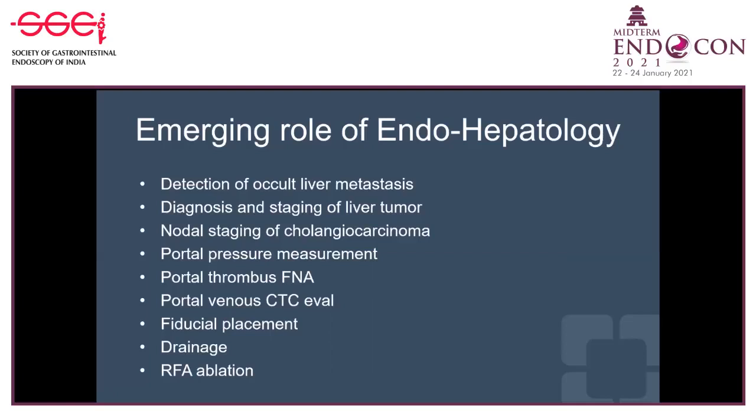We use fiducial placement in the liver for adequate treatment of the liver tumors. And of course, as everybody knows, endoscopic ultrasound is also routinely used for biliary interventions for drainage procedures, abscess, or for palliation of jaundice. Last but not the least, there is again emerging data on the role and use of radiofrequency ablation via endoscopic ultrasound for liver tumors.